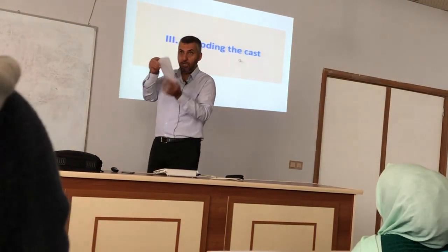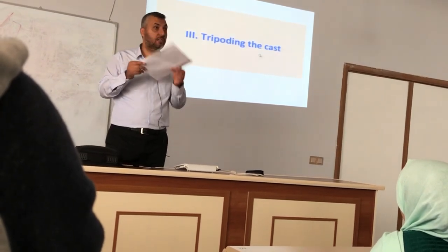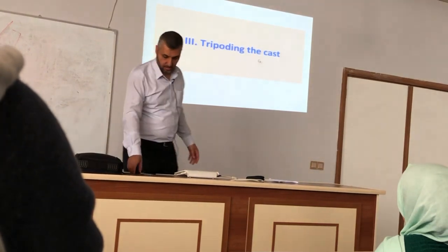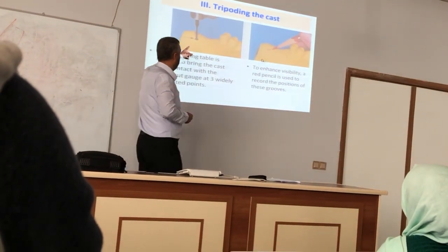1 or 2 millimeters of tilting will change the survey line. Tripoding: we make marks, points.